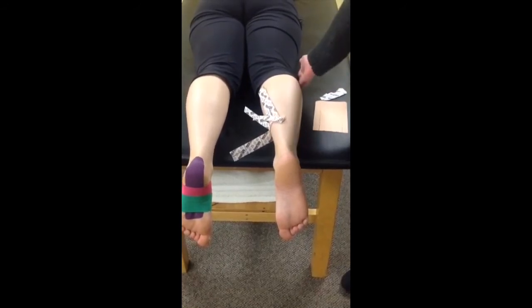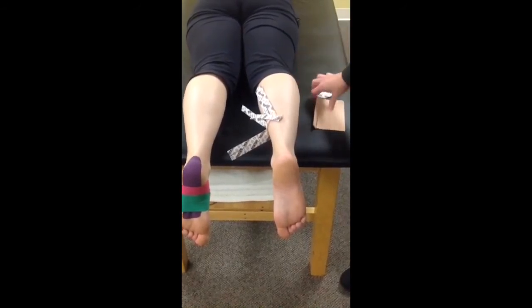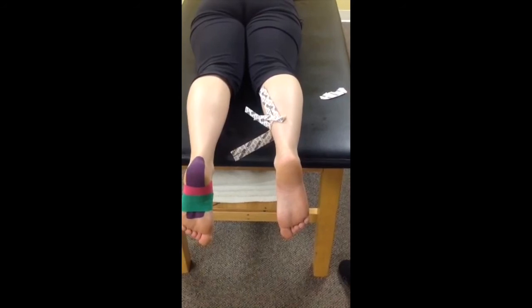Now if she had swelling at the knee, we could put the tape over the knee — not behind the knee.